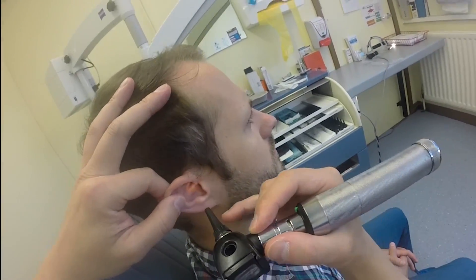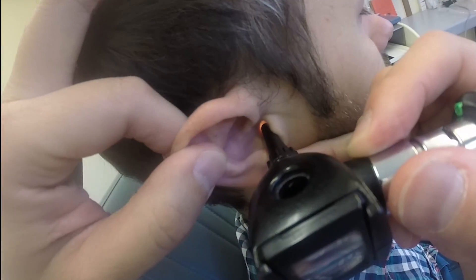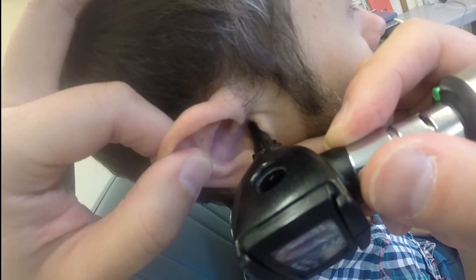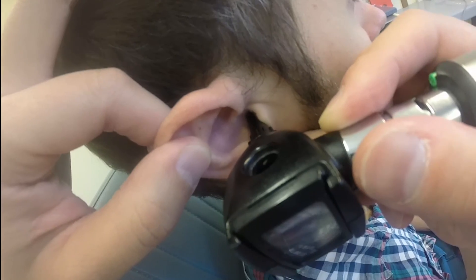And then you pull the pinna back and very gently insert the otoscope into the ear canal. First of all look at the ear canal to look for any lesions, and then you look for the eardrum.